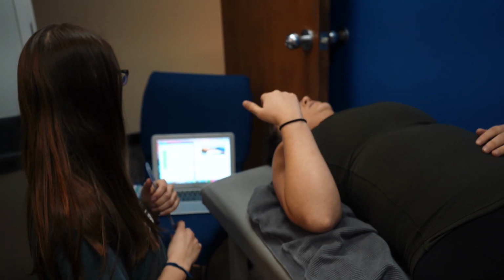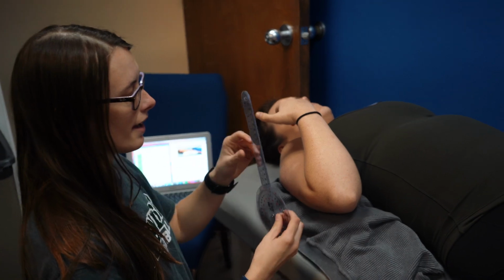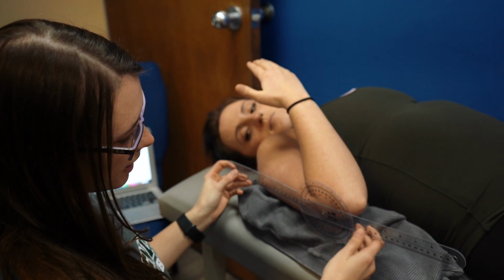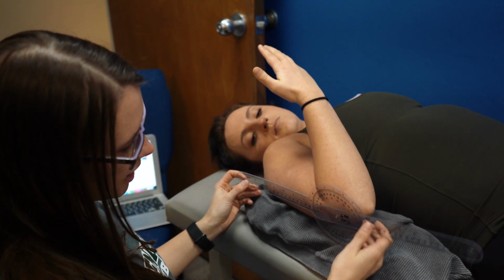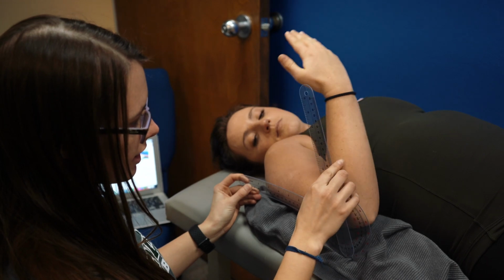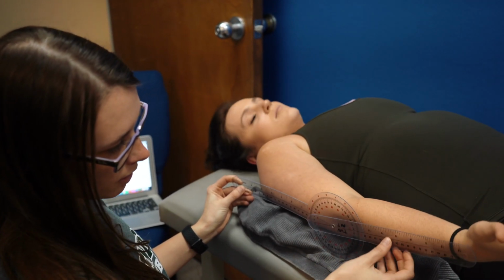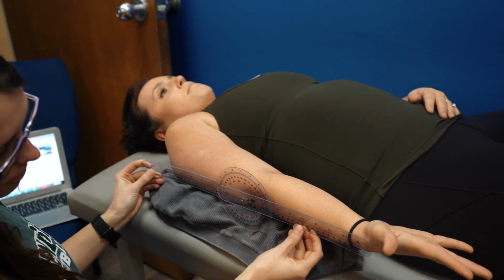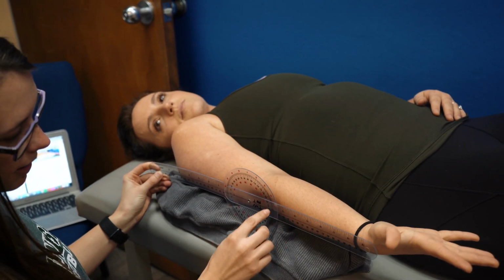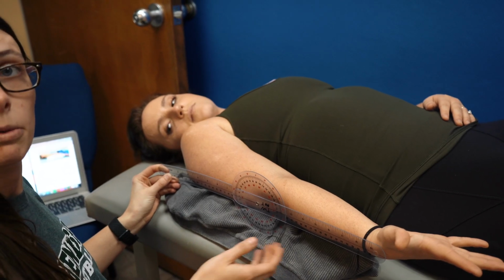Alright, so now we are testing extension of the elbow. So we're going to have the fulcrum lined up at the lateral epicondyle. And Kennedy will already be in a flexed position, so we're going to have her extend her arm. Okay, so the moving arm is going to be lined with the radial side of her hand, and it's going to be at 180 and 0, so she's in normal range.